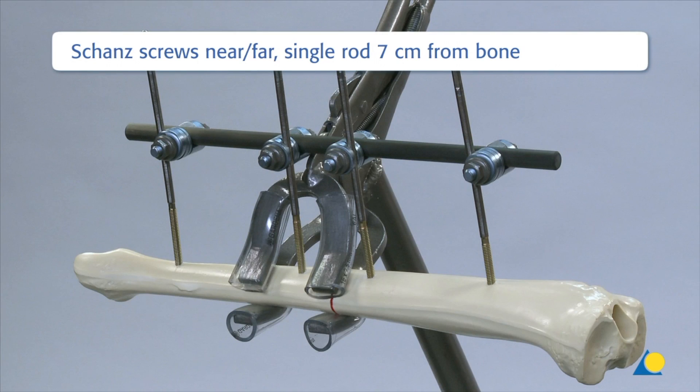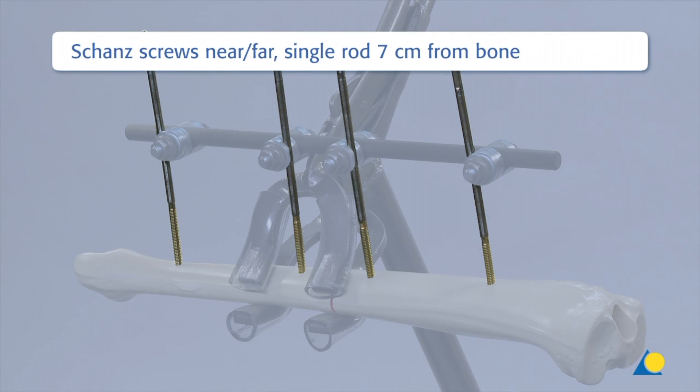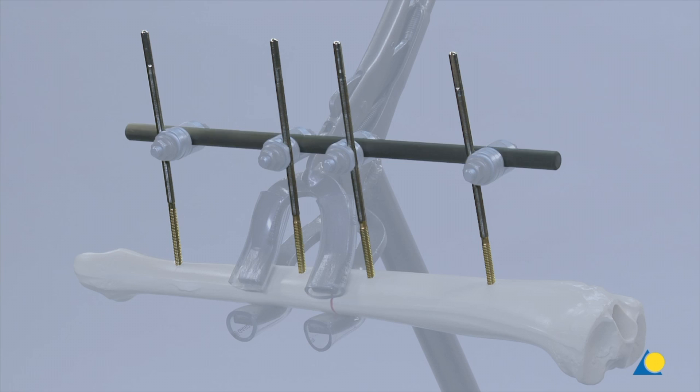In this single rod construction, the Schanz screws are placed in the near-far position. The rod is placed 7 cm from the bone and secured with four large open self-holding clamps.